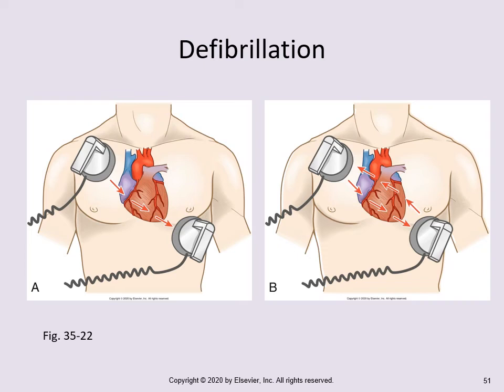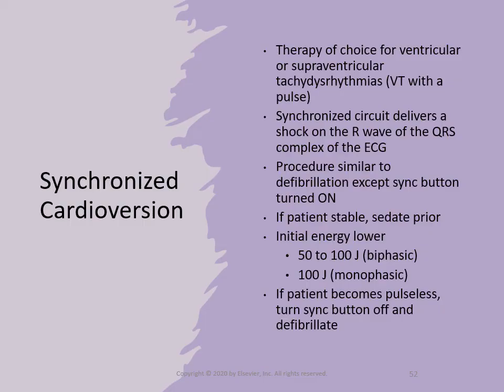You want to be sure some kind of conduction agent is used. It could be a gel that you apply or gel pads, but something goes between the skin and the defibrillator paddle. Then you will charge the defibrillator. Once the defibrillator reaches the desired energy, you're going to say all clear, and you're going to press the button that allows the energy to actually be delivered. You do want to make sure that you position the pads firmly on the chest wall and hold them close as the energy is conducted.